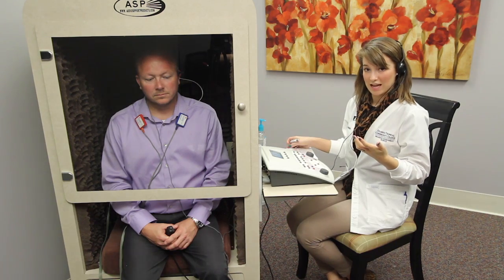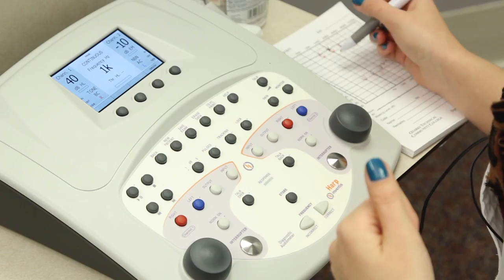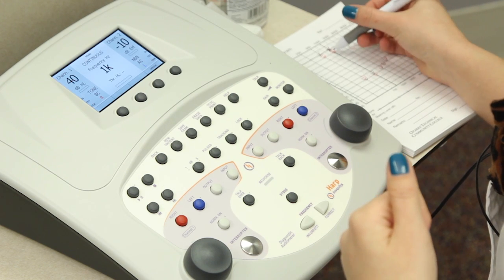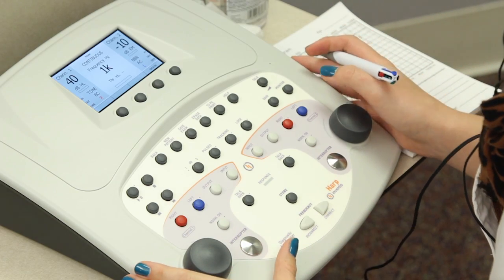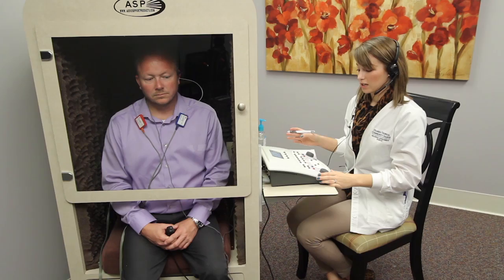Our starting levels are going to be the same as air conduction — we're going to start at 40 decibels. Our masking levels will be 10 decibels above the non-test ear's air thresholds. We're going to start at 1,000, work up to the high frequencies, and then go back down to the low frequencies.